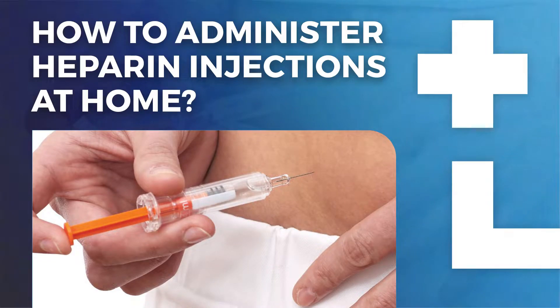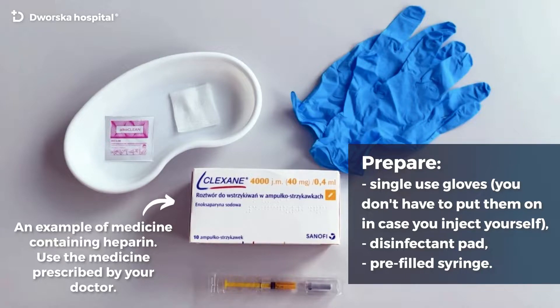How to administer heparin injections at home. This is an example of medicine containing heparin. Use the medicine prescribed by your doctor.